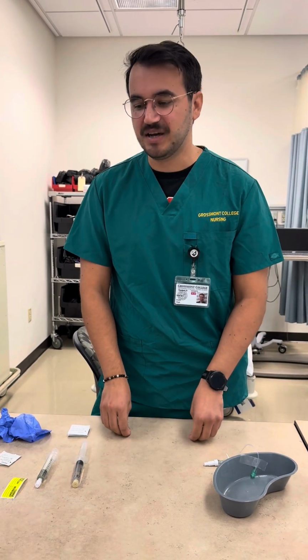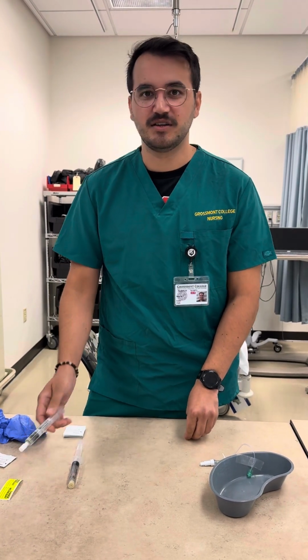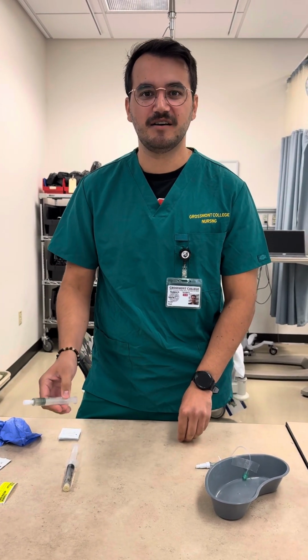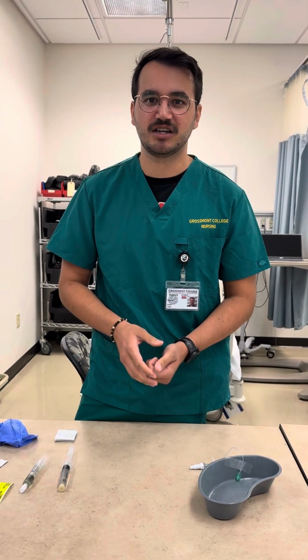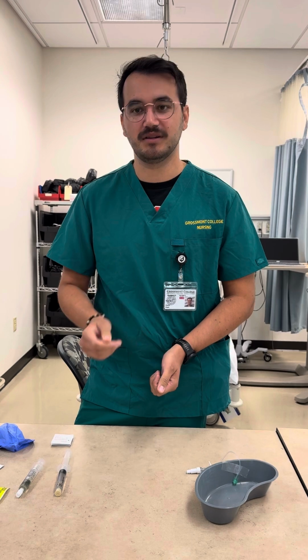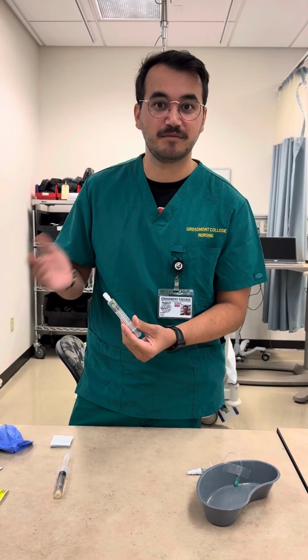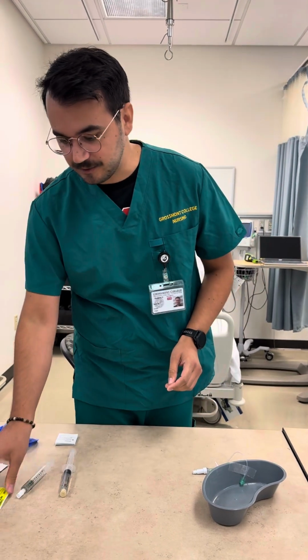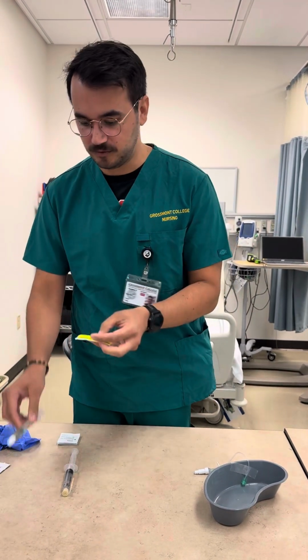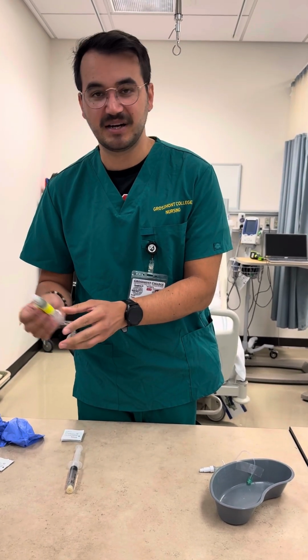symptom. The patient's symptom is nausea and vomiting, and for that, the doctor has prescribed 10 milligrams of metoclopramide, also known as Reglan. The concentration that medication comes in is 5 milligrams per milliliter. So if I have a dose to be given of 10 milligrams, I have 2 milliliters, as right here. I'm going to ensure that that's properly labeled with the time that it was prepared, as well as the medication that it actually is.